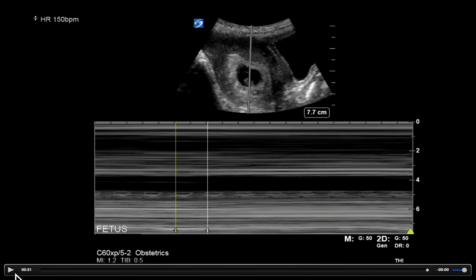Pretty simple. You want to hit M-mode, place the line over the fetal heart, then hit M-mode again or start depending on the machine. Then hit freeze — that will give you the tracing frozen — and then hit calcs, which may say 'fetal heart rate' depending on the machine. Pay attention to whether it says a one-beat or a two-beat measurement, and that's where you do your measurement.